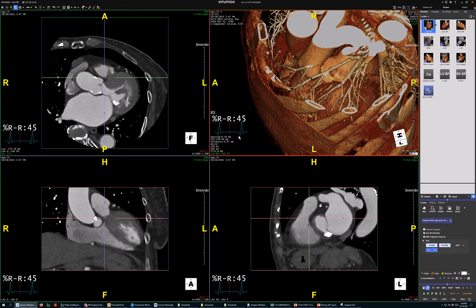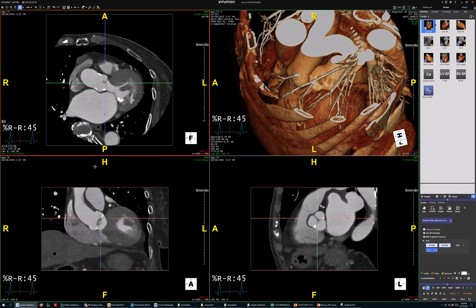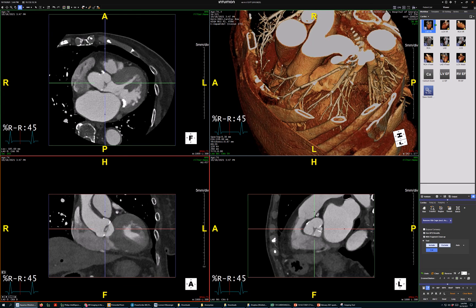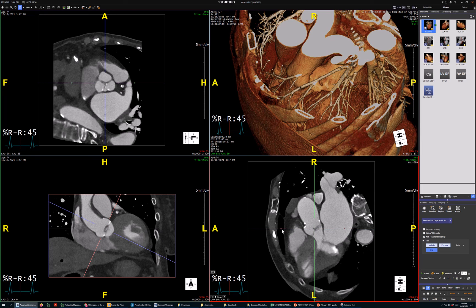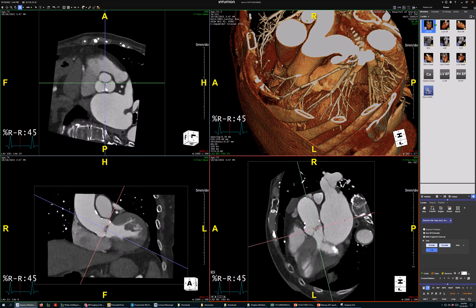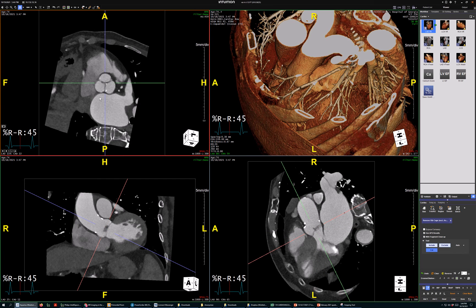I'm going to try to do it with instructions. If you hold down the ALT key and left mouse click, you localize on your area of interest — in this case, the aortic root. If you hover over this little dot, left mouse hold and rotate the axes counterclockwise, then come over here to what's now a pseudosagittal, hold down the little dot counterclockwise, you approximate the plane of the root up here. This is a pseudoaxial now.